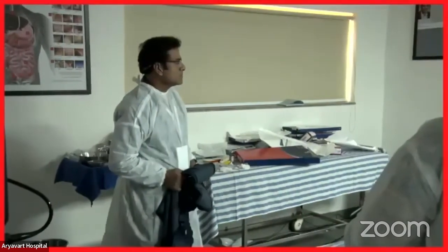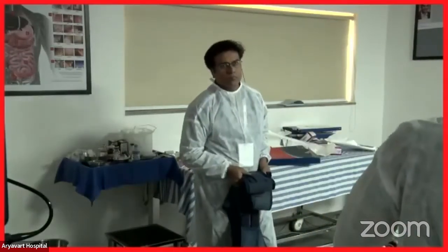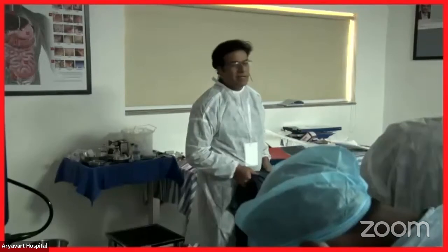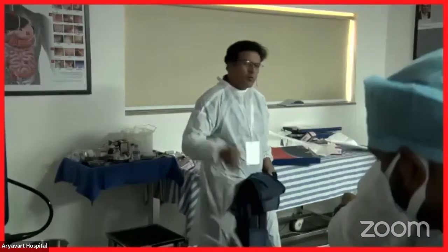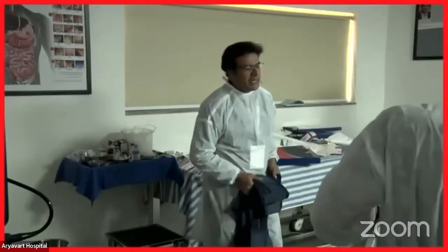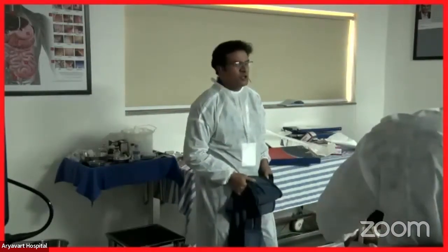If you use radiologic contrast, it will be much easier to find the small bowel. Yes, along with the fluid, you add contrast. Yeah, this is what we actually did. The fluid that we used was normal saline with contrast and methylene blue. This is the solution we used.